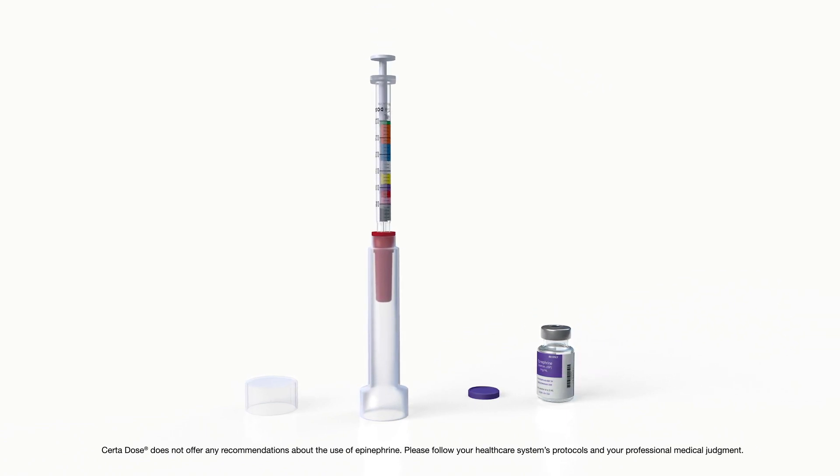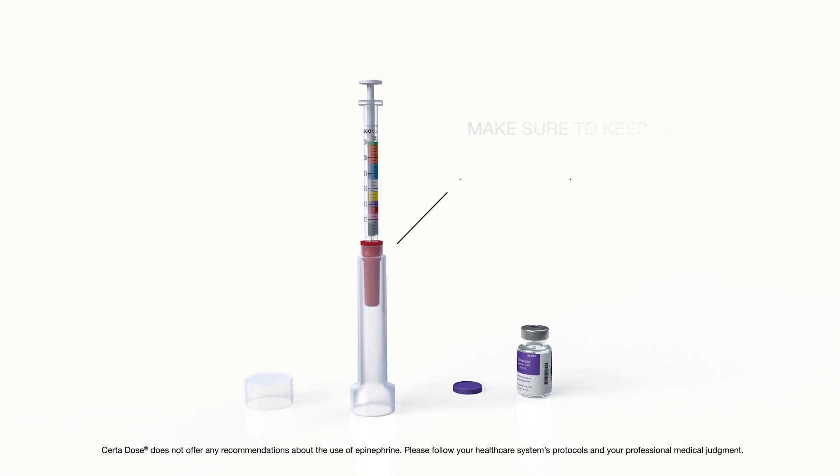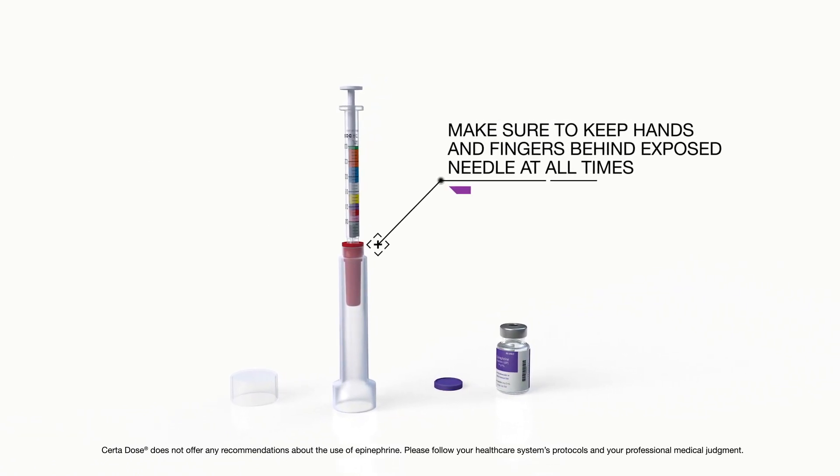With the integrated needle safety device on a secure surface, secure the needle for disposal. Make sure to keep hands and fingers behind the exposed needle at all times.